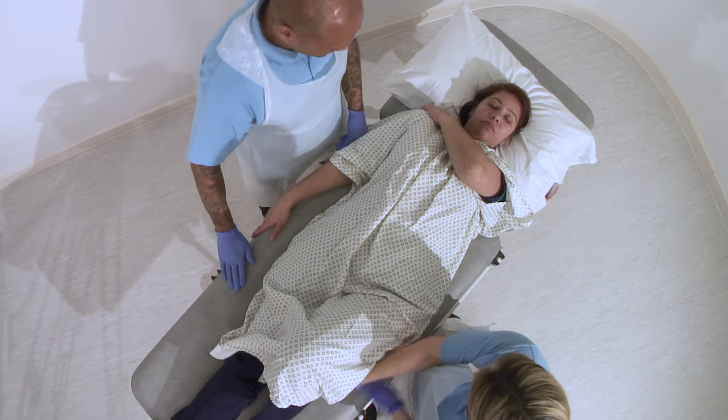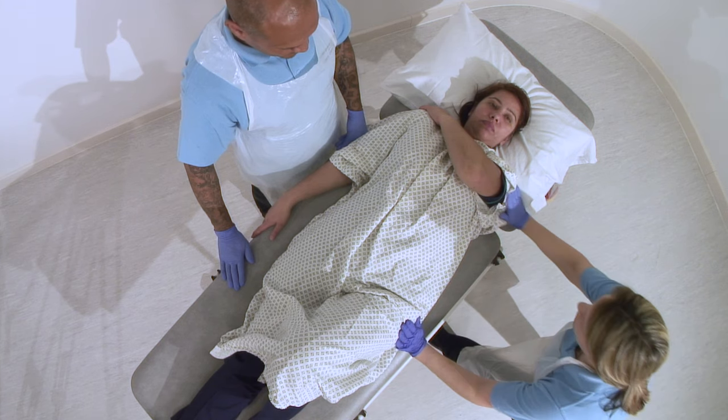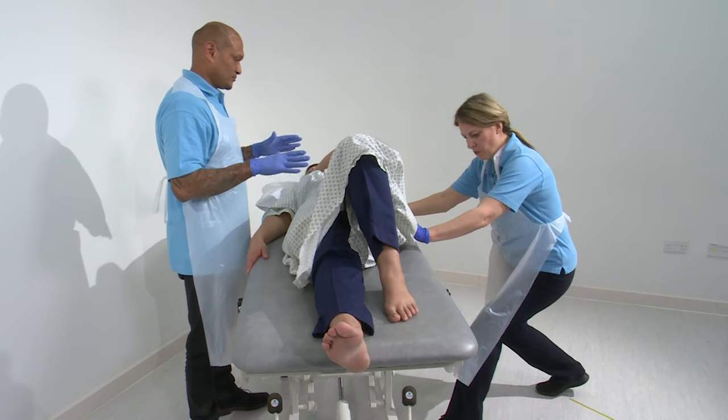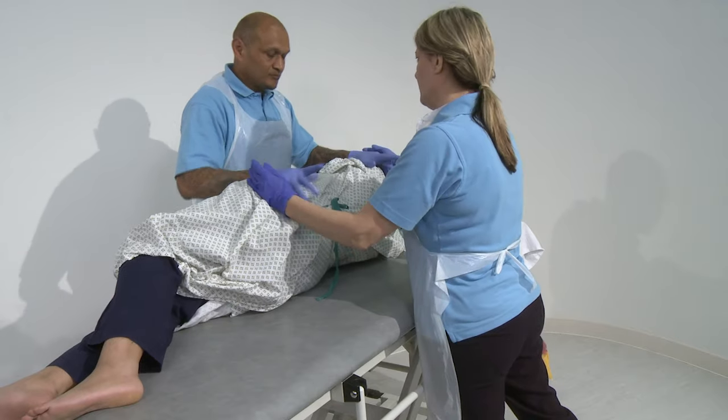You happy there Niha? Now I'm going to take hold of my hands, place one on the hip and one on the shoulder. Can you look at Rob for me please? Now all I'm going to do is lunge in and take you up towards Rob. Happy there? We've got her.